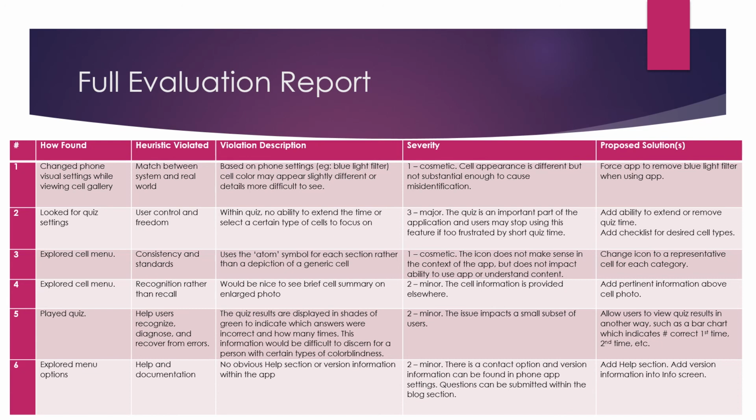So this is my full report. Overall, I think this is a really nice app and I was really happy with it. It was super easy to use. It was super easy to set up. It is geared towards professional lab techs, so if the information seems kind of high level, the anticipation is that people who are using this have already gone through some level of hematology training.